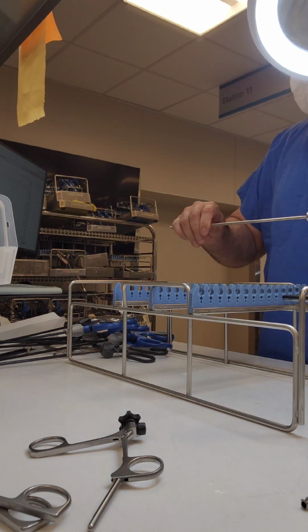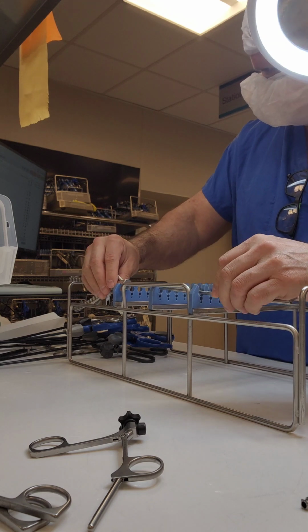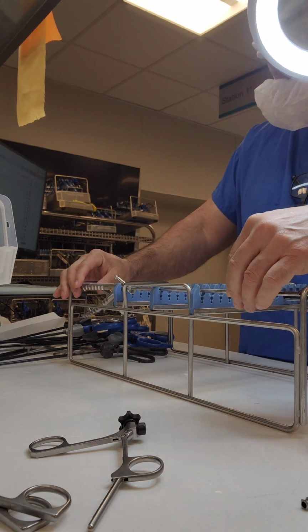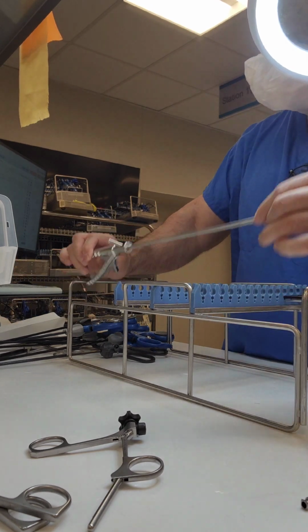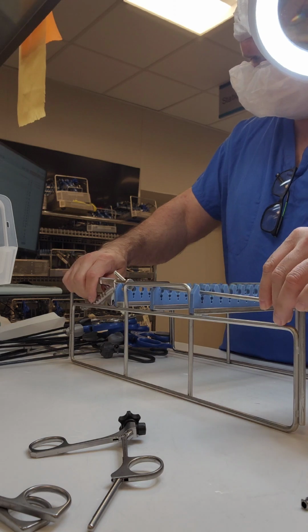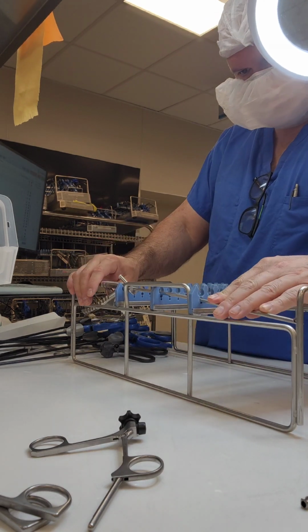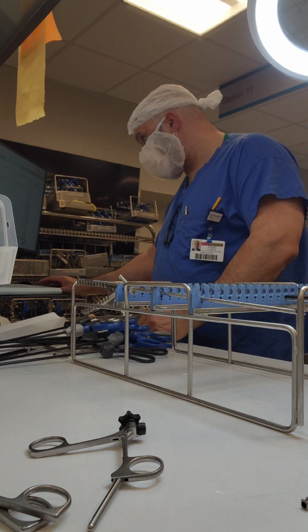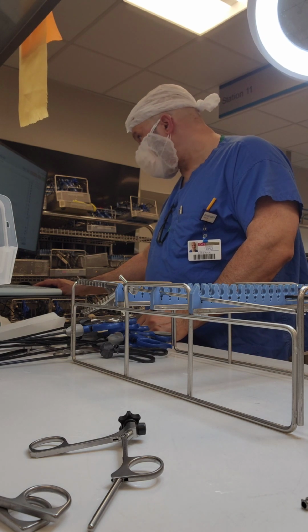This is one of the needle drivers here. Actually, I just put this on the rack. I should have inspected that one. So I just reminded myself, wait a minute, Jesse, did you just put that on the rack and not inspect it? Shame on you, buddy. Make sure that sits on the rack there. Okay, grabbing it again.